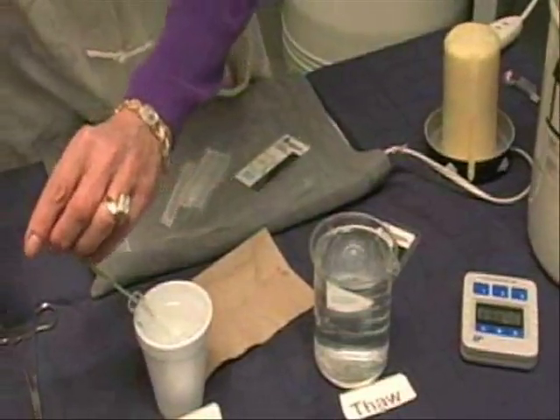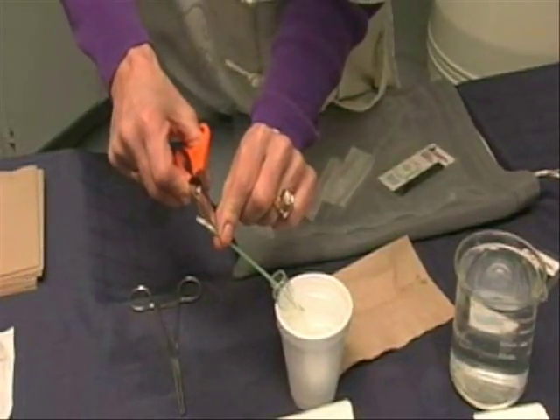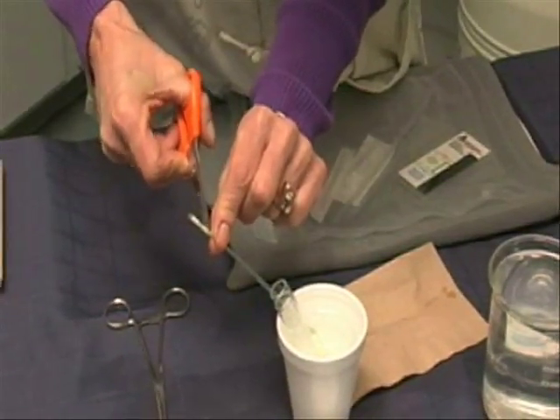Hold straw with the open end over the warm thaw media in the culture tubes. Cut the straw just below the cotton plug. Semen will run into the thaw media.